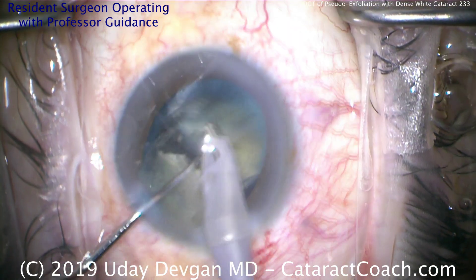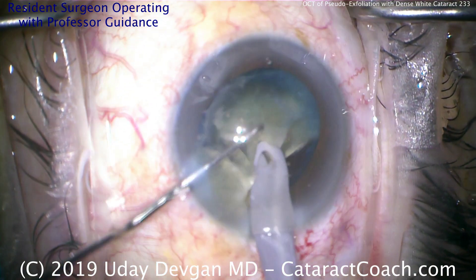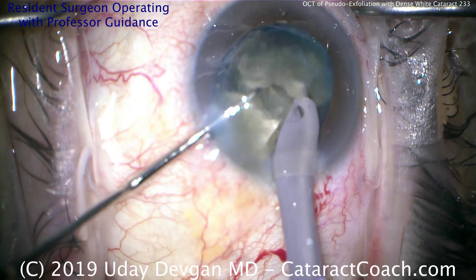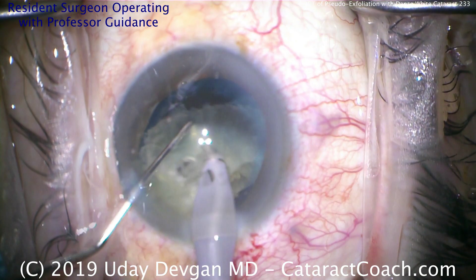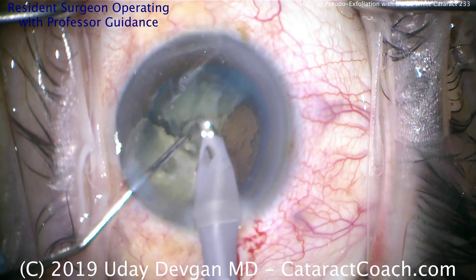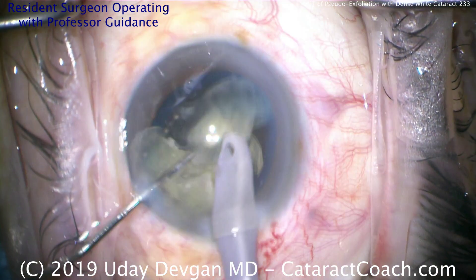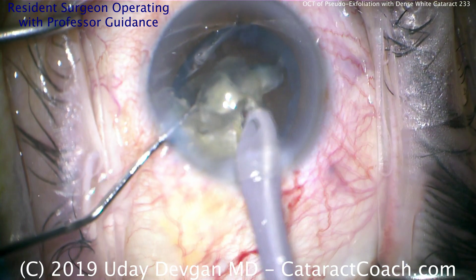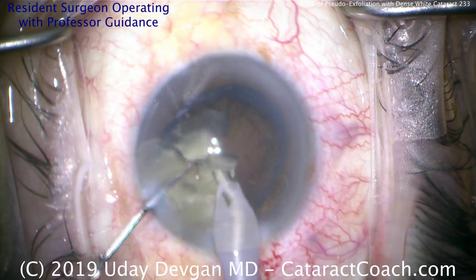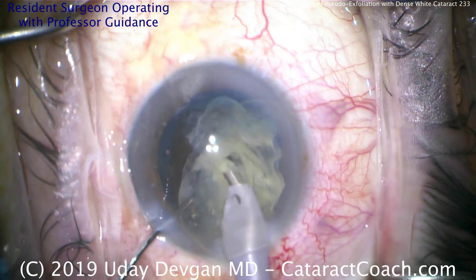Buzz in again with the phaco probe — you have to hold it with the phaco probe, and then you can chop it. Now on a white cataract like this, sometimes these pieces are a little bit fibrous and the chop doesn't fully propagate through. That's okay — take your time, try again, buzz in, and remove whatever fragments you can.